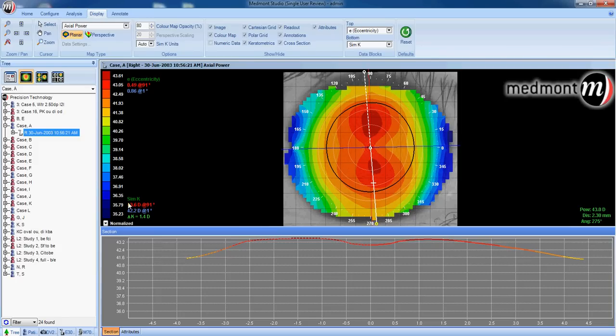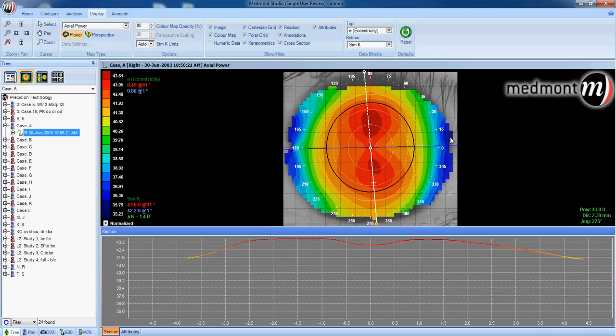Next, we can look at the scale range along the left-hand side. Notice the topographer is showing us the flattest it can read is 35.23 diopters here.